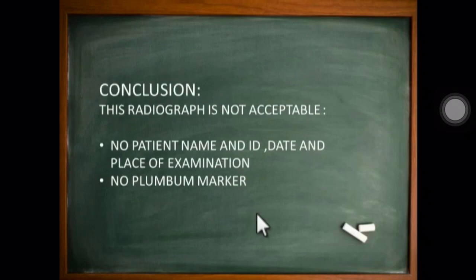Conclusion, this radiograph is not acceptable because there's no patient name and ID, date and place of examination, and there's no lead marker. And that's all from me.